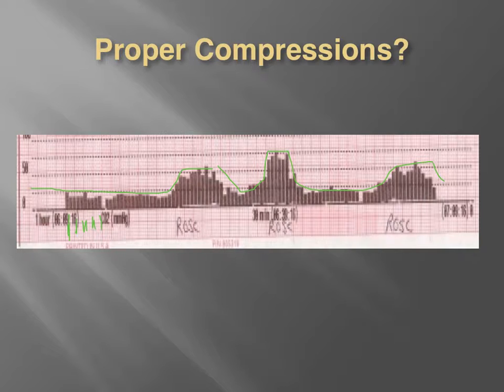So this is a good illustration of what we'll be covering here in a few moments, of where you're doing CPR. You may not have optimal cardiac output, which is what's reflective here. And then once the patient regains pulses, there's a little bit of a CO2 washout that flushes out of the system because perfusion has increased that much better because the heart has started beating again. Okay, so then you have that CO2 washout, and sometimes it does level out.